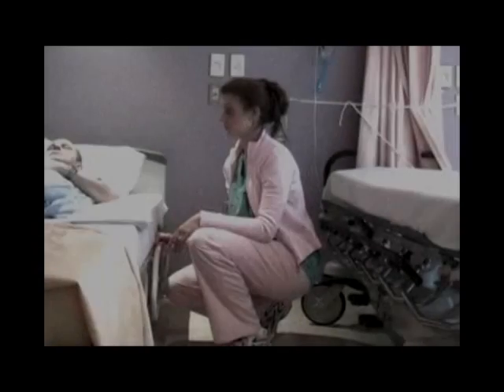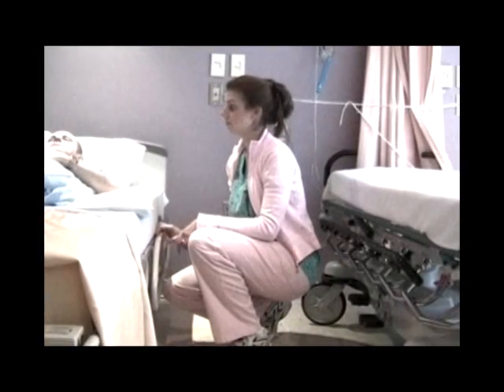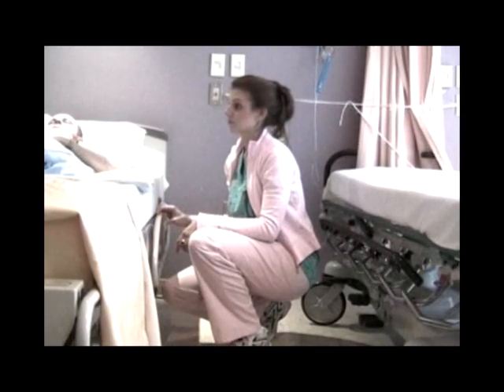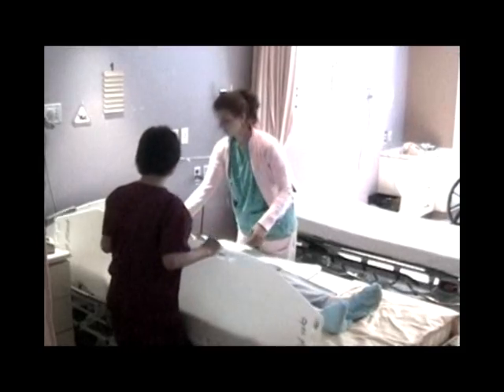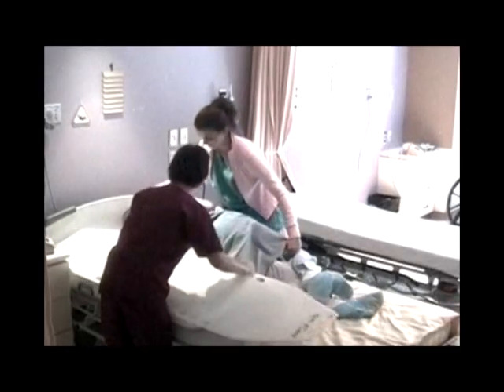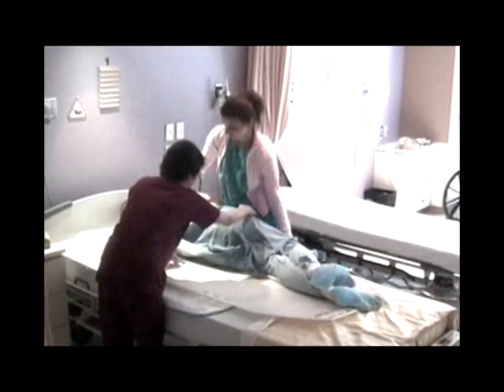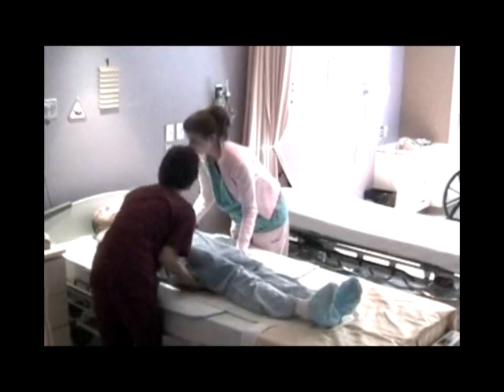Procedure for the bed to stretcher transfer using the slide board. Remember, prepare the environment, prepare the patient, prepare yourself. Raise the bed to mid-thigh level. To position the slide board under the patient, first cross the patient's arms across their chest. Roll the patient towards the lead caregiver by grasping the patient's far shoulder and hip or their bent knee. Place the board underneath the patient. Roll the patient back down onto the slide board, repositioning as necessary.